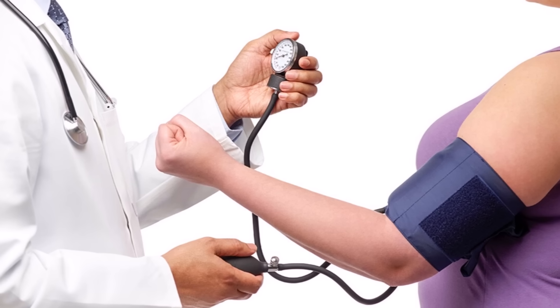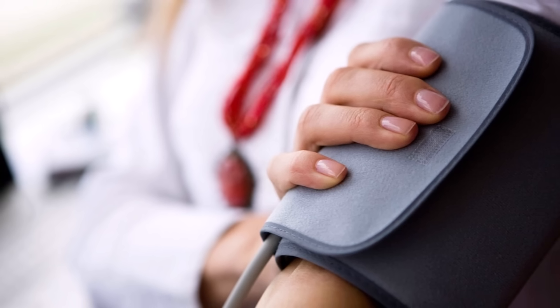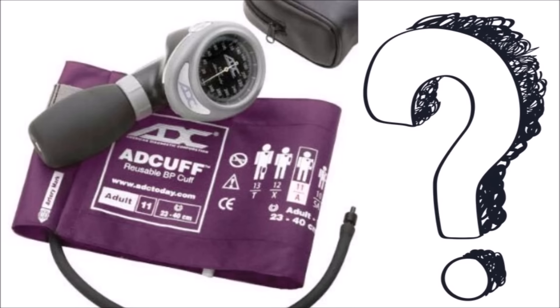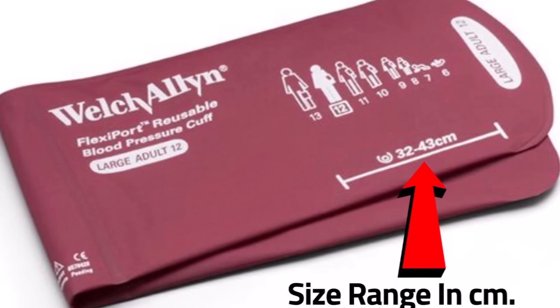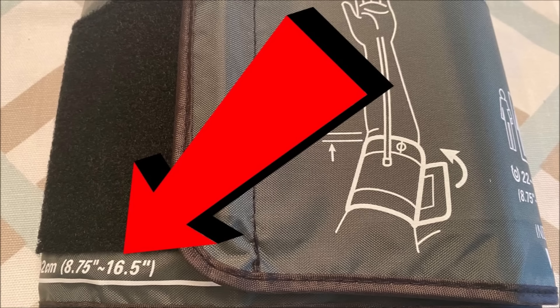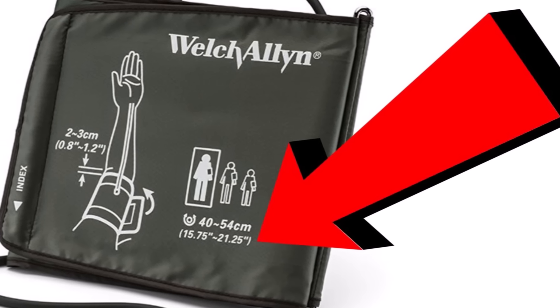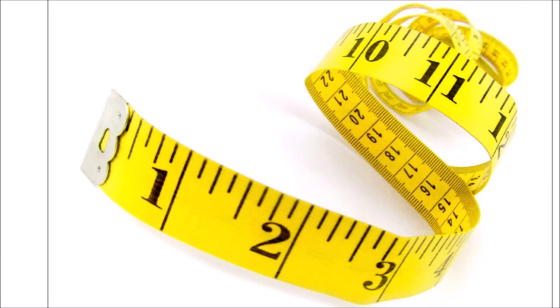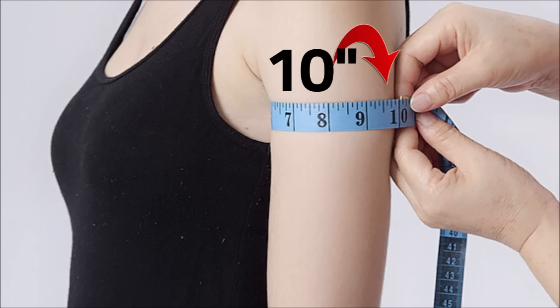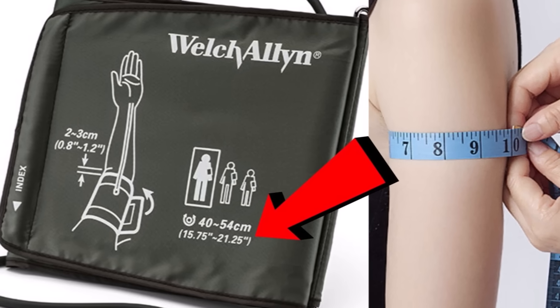If your cuff is too small, your readings can be falsely high. And if the cuff is too big, your readings may be falsely low. Most cuffs have a size range written right on the cuff. My cuff size has a range from 8¾ to 16½ inches. It's essential to measure your upper arm to see if it fits into the range of your cuff. Take a cloth measuring tape and wrap it around your upper arm while it's relaxed, hanging straight down. If the size of your arm is not in the range, you need to change your cuff.